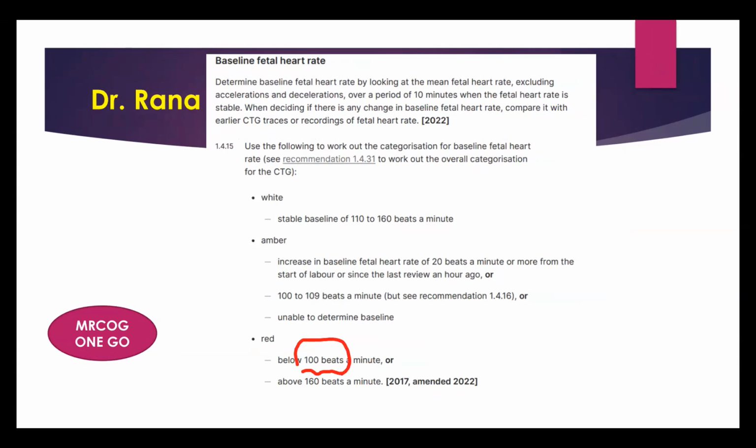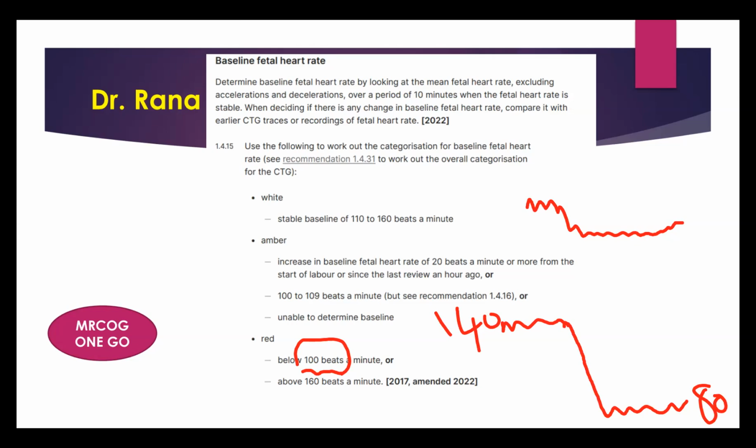We may have the CTG from the start, like 110 and 100 and so on. But if we have the basal heart rate 140, and suddenly this fetal heart rate 80, this is the acute bradycardia. Suddenly reduction of the fetal heart rate. If it's from the start, it's not acute. It's from the start, we have bradycardia. We have here below 100, for example.